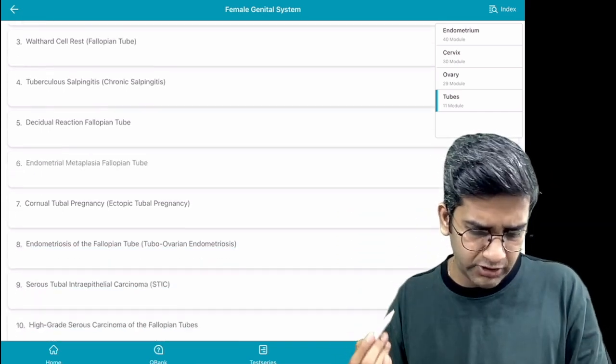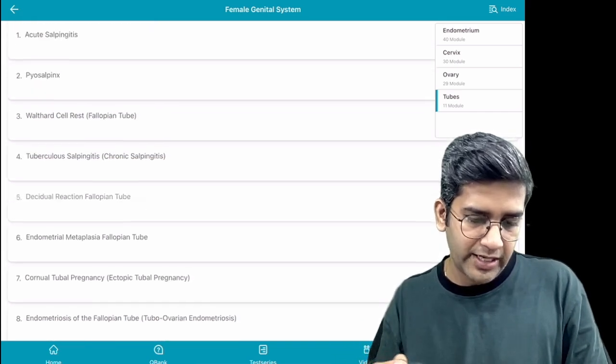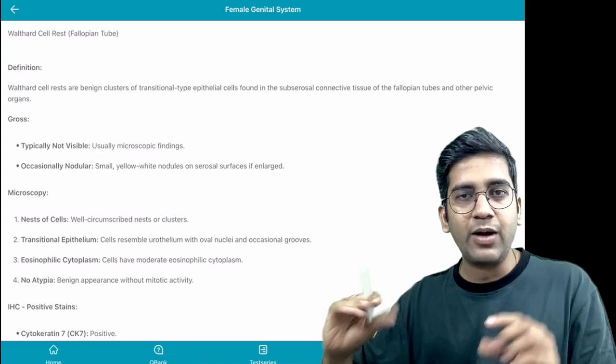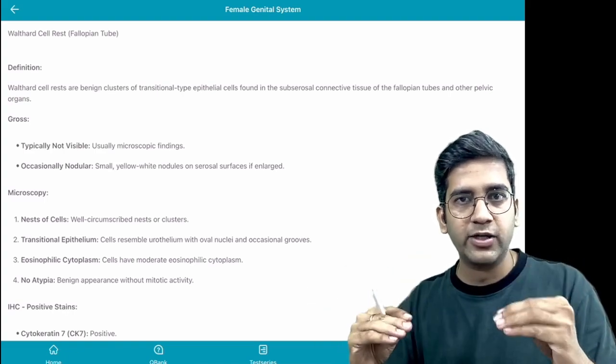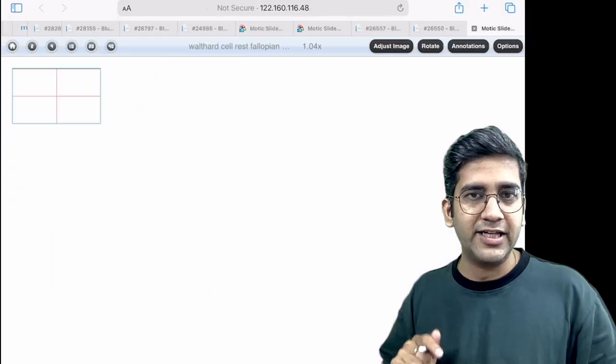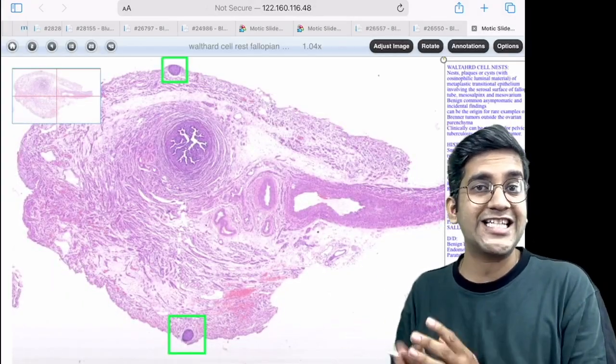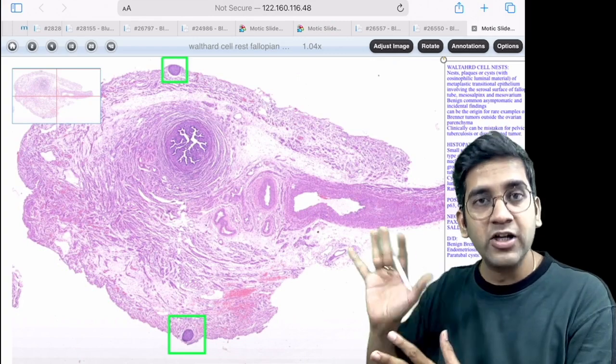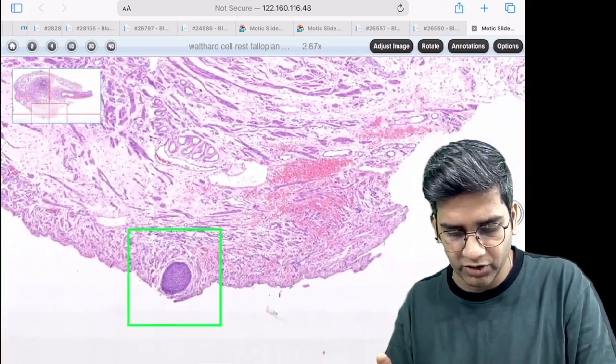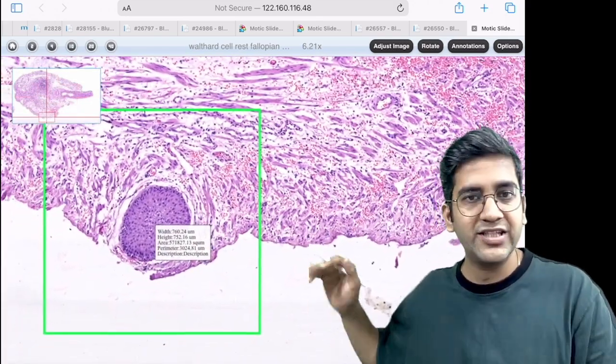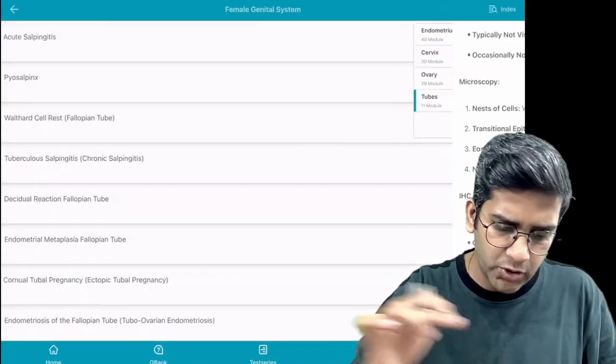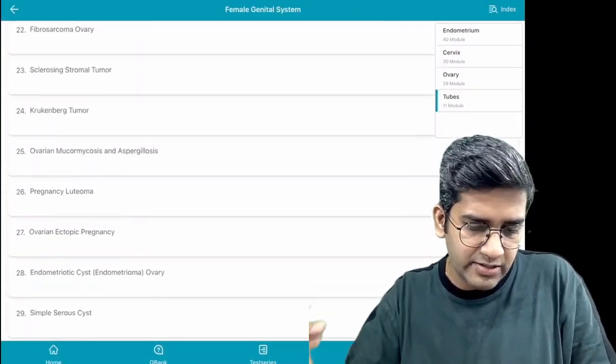Let's say I want to look at tubal pathology. I'm a first-year student and want to know what is walthard cell rest. I click on walthard cell rest and you'll have the definition, microscopic gross, whether IHC is required, and then a slide. You click on the slide and it opens. The beauty of this is it's a self-learning tool. If you're in the middle of the night with no one to guide you, go for RXDX Pathology.